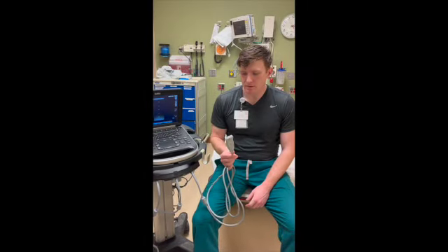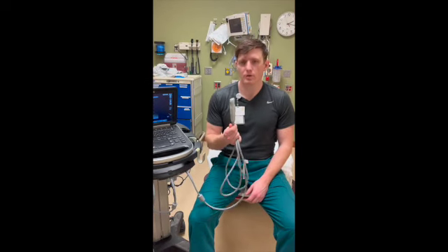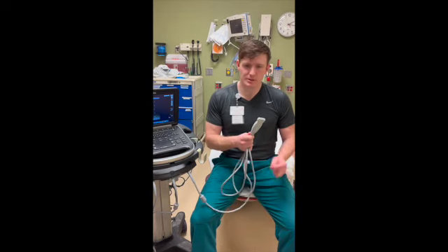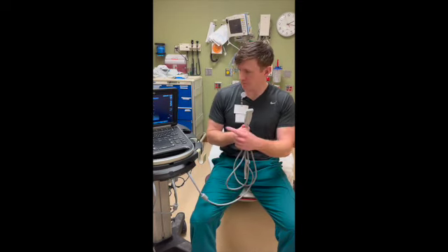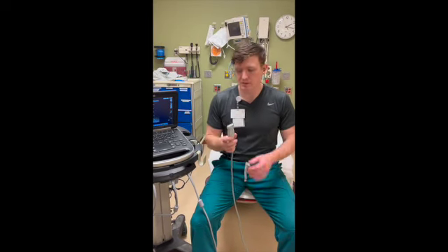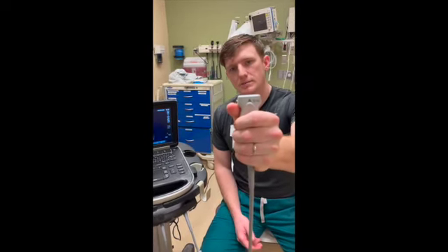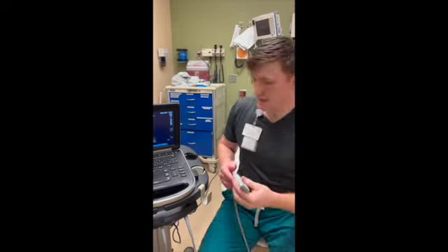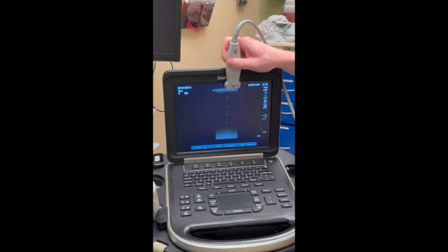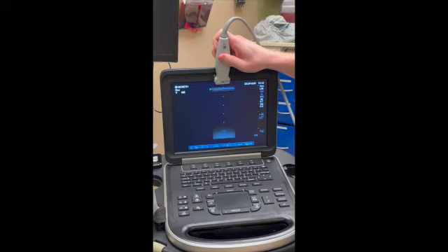One thing that people first starting out have trouble with is they don't know which way to orient their probe. Sometimes if you move the probe left, you'll get a shift right in the picture. A rule of thumb: the indicator on the probe — that small ridge — must line up with the indicator on the screen, the green dot. Always, no matter which side of the patient you're on, keep those in the same orientation: left to left.